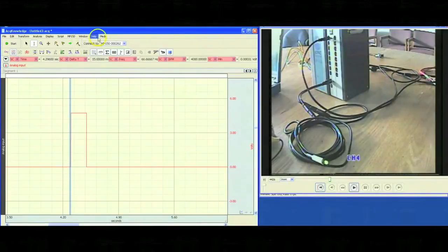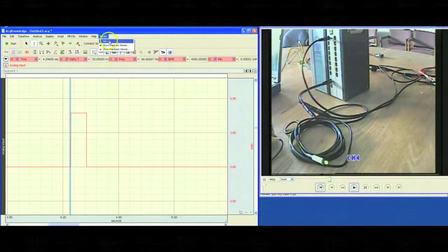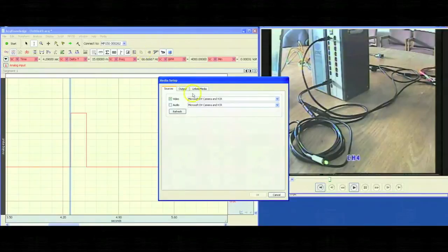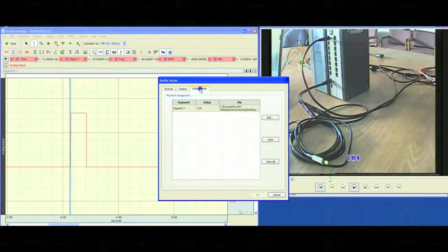What we can do is then go back to the media menu, click on setup, go to our linked media, and edit our delay.